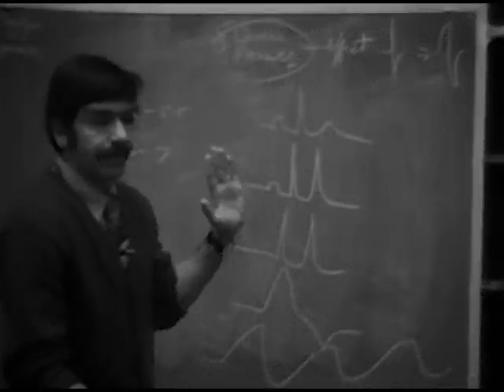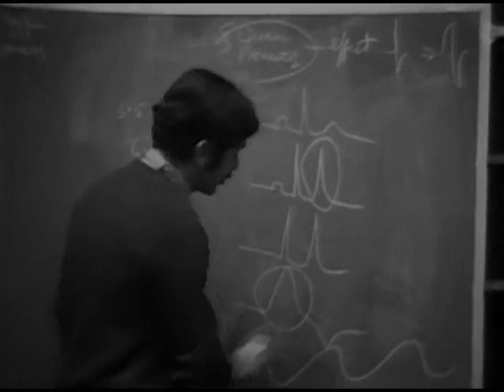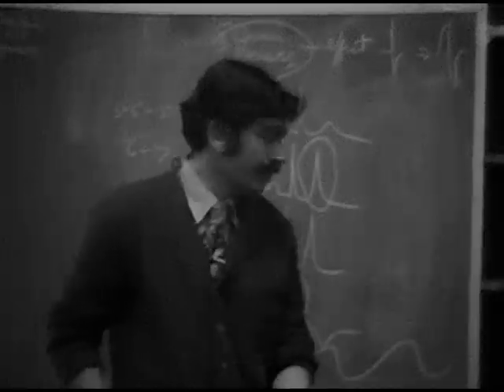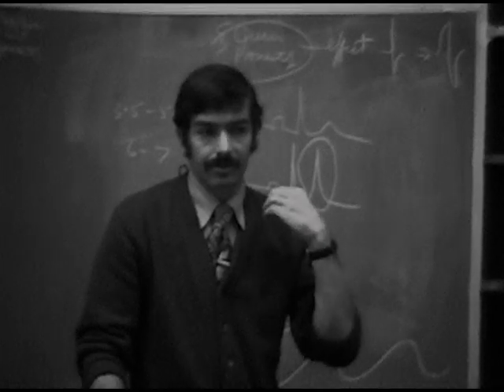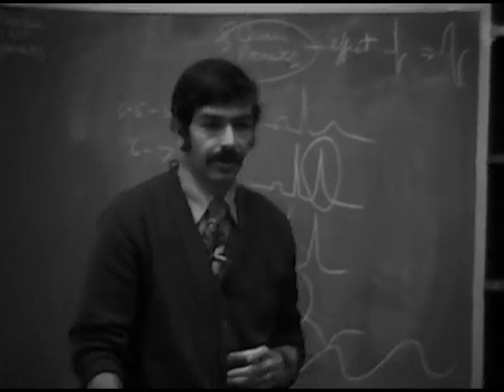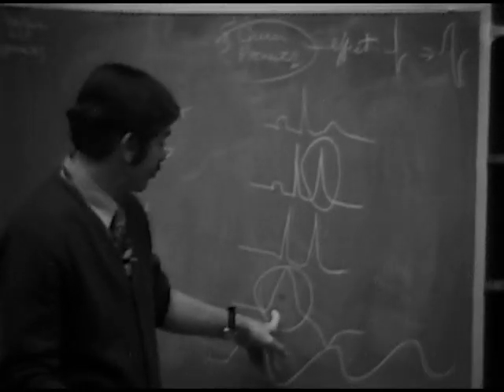But the most common way that we see patients presenting with hyperkalemia is like this, with T wave peaking, and like this. And there are many patients now, I can think of at least 3 so far this year, that we've seen that presented like this, looking like complete heart block with an idioventricular rhythm. So anytime you see that situation, you should think, especially with no prior history of heart block or a patient who's recently been in normal sinus rhythm, I wonder if this patient doesn't have hyperkalemia, and try to anticipate the possibility.